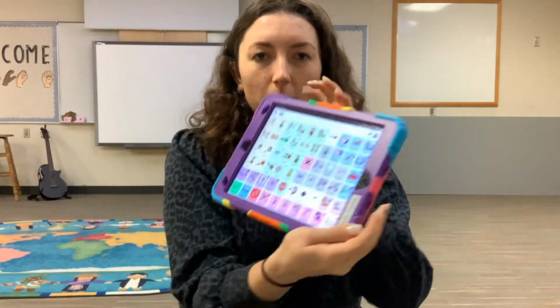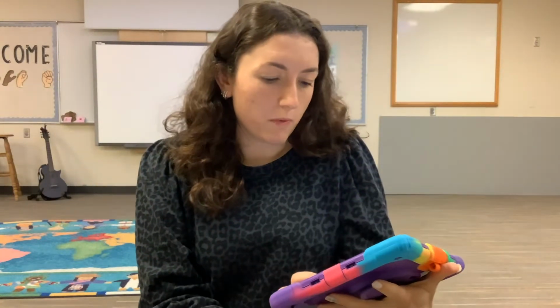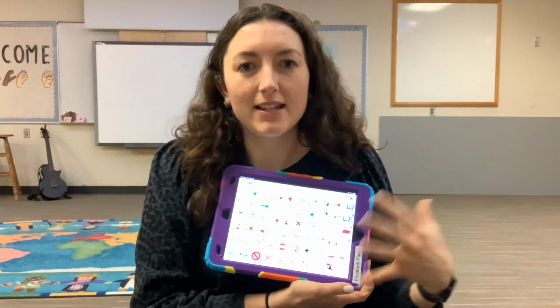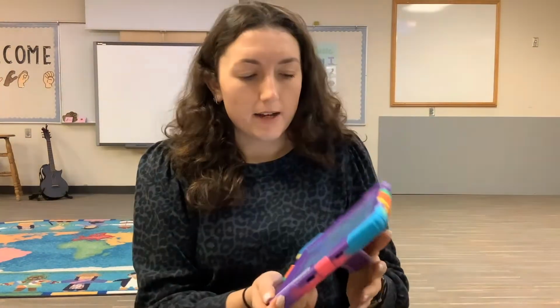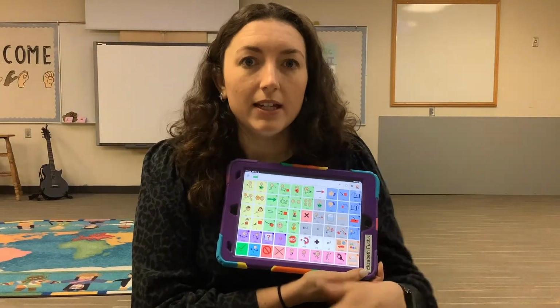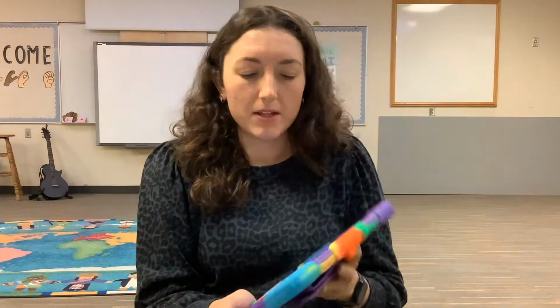So here's our home board. This is a lot of what the kids at Jordan Valley have. It's a 6C board. And so one really good tip is to stay on the home board when you're modeling with your student or communicating with them. A lot of this vocabulary is stuff that we all use in our everyday life, so it's something you can use in any situation, and you can use it to communicate, to request, to do lots of different communication functions. So, and it is easy and accessible.